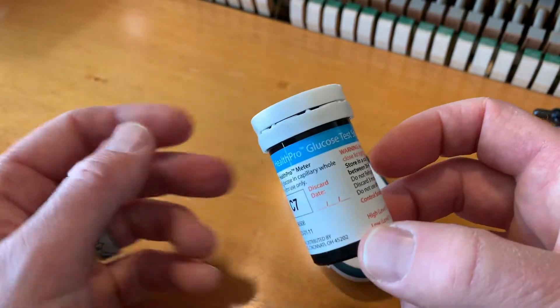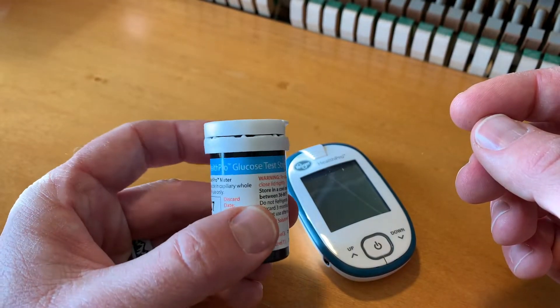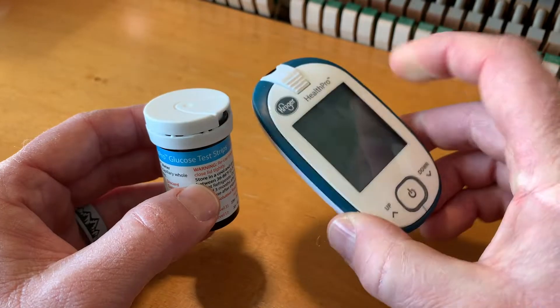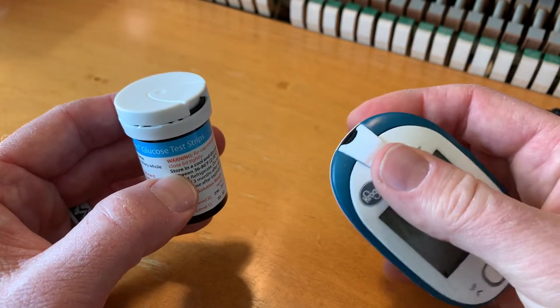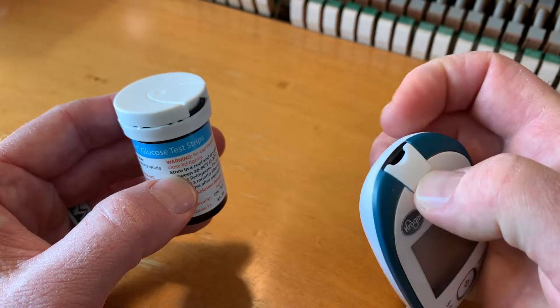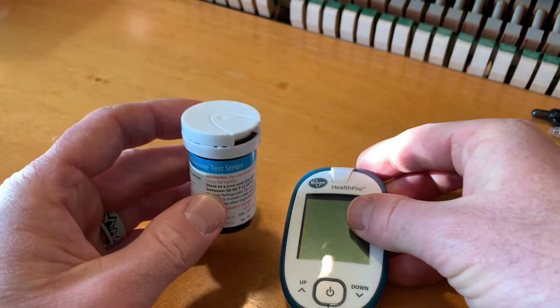For this tutorial, I'm going to show you how to insert it the proper way that Kroger shows you. We've got our glucose health monitor — you don't need to turn it on, which is really nice. We've got our tip over here where we insert the plastic strip, and this is going to automatically turn on once we do that.